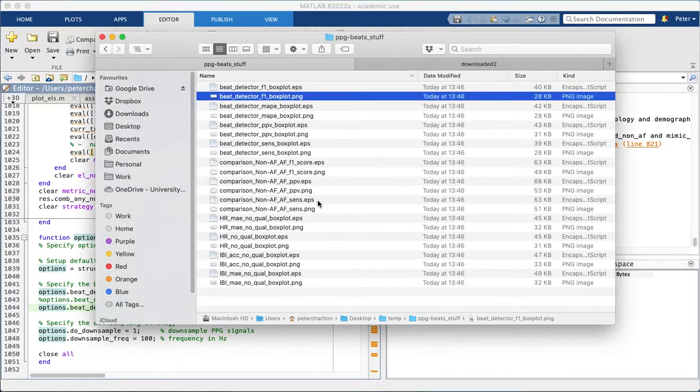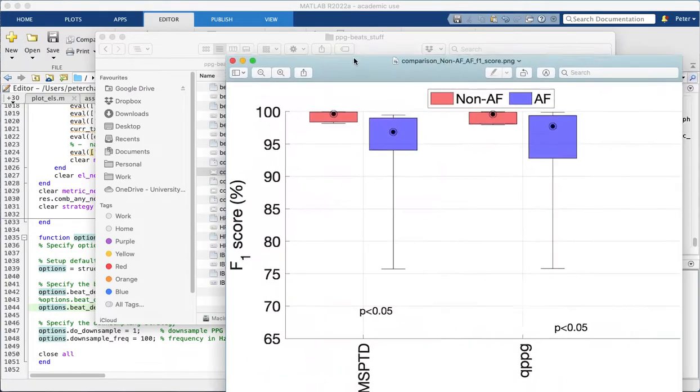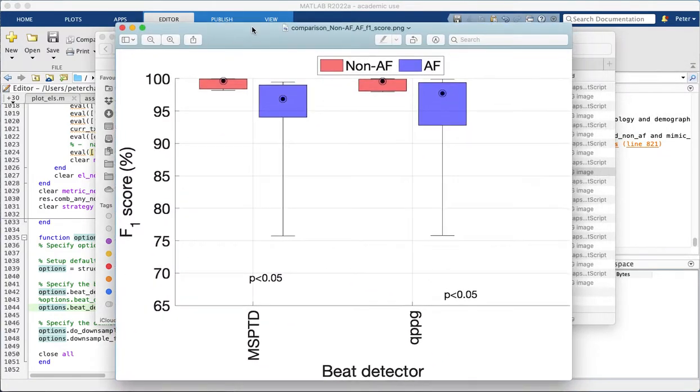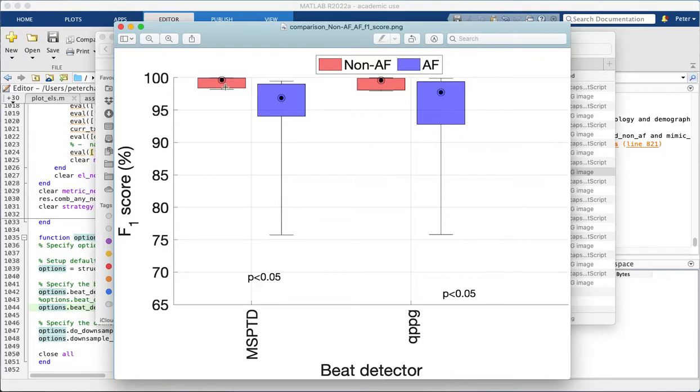We've also told it to compare performance between AF and non-AF patients. So here again we have the two beat detectors, MSPTD and QPPG, and we have the results for non-AF patients in red and for AF in blue. And you can see that for both beat detectors, there was significantly worse performance in AF. There are a few other plots that you can have a look at.